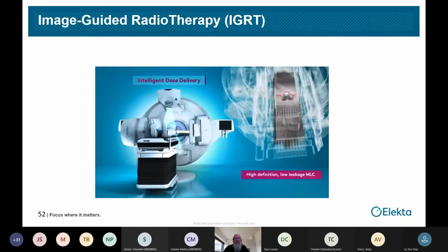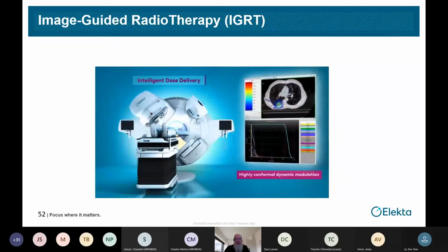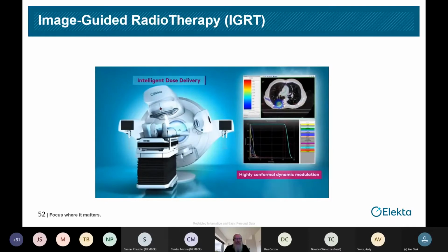So that way, if you've had lunch today and when you had your scan you hadn't, and your stomach is now bigger, the tumor might have moved over. But we can tell that beforehand now, and that means we can reduce that big red shape, that planning treatment volume. We can reduce the size of that, which once again, if we can conform better to the tumor, we can put more radiation in the tumor, less in the healthy cells. That means you're going to have fewer fractions and you're going to have better outcomes.